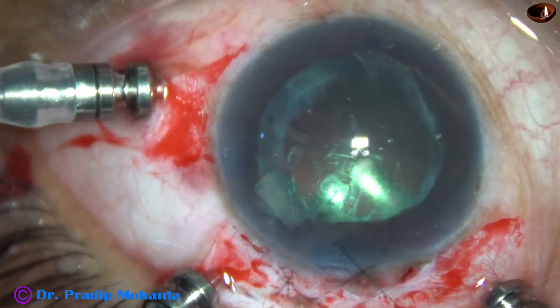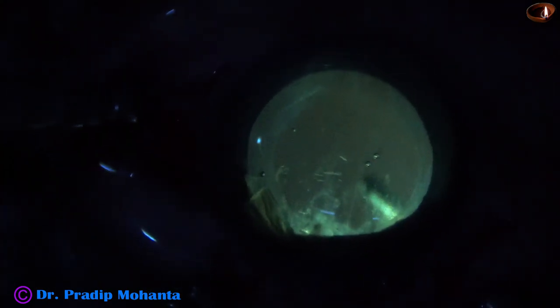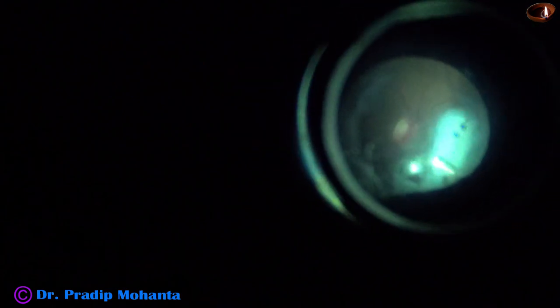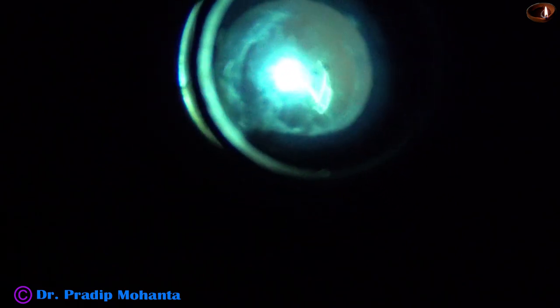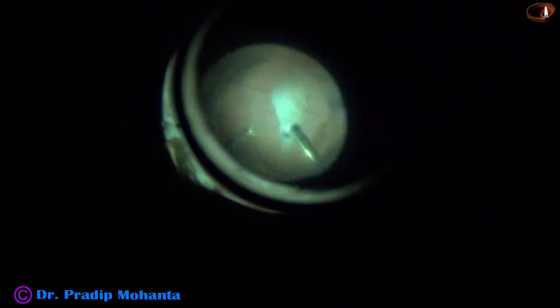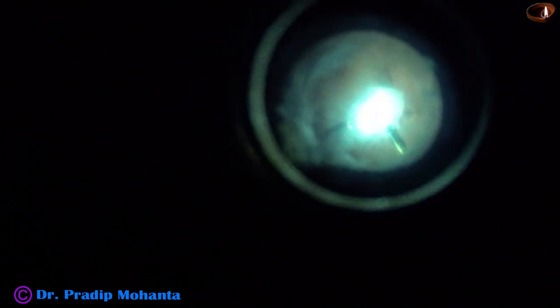This is a 23-gauge cutter. After doing vitrectomy for some time, I put the irrigating contact lens and I can see the optic nerve head, macula, and mid-periphery very nicely. This is a very economical device — this irrigating contact lens is available in India; Madhu Industries from Delhi makes it. We can very nicely remove the epinucleus and cortex by the cutter itself.